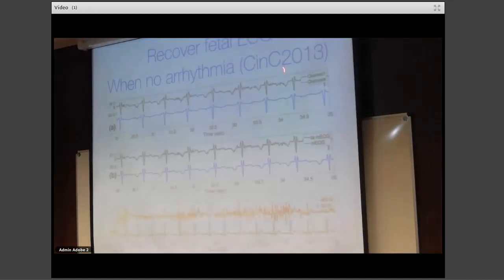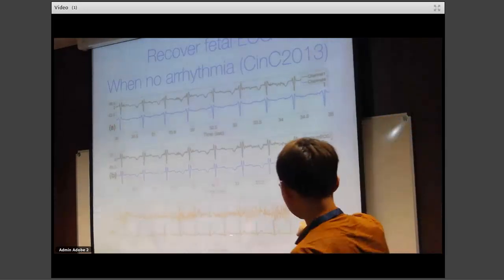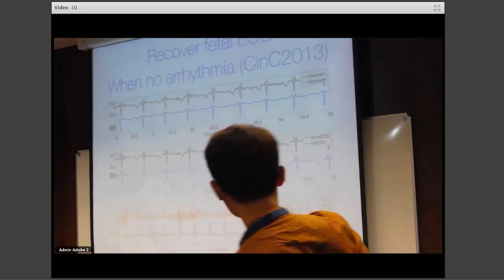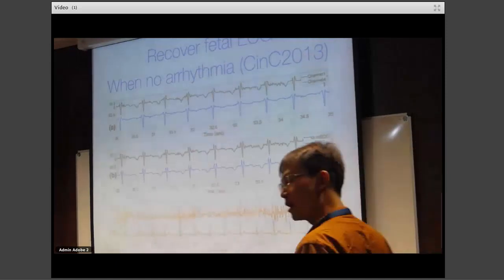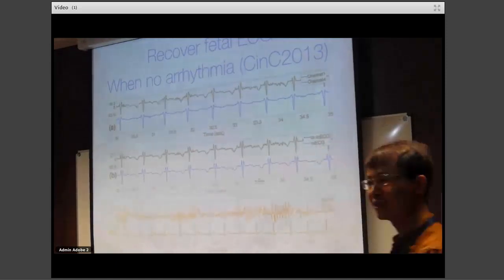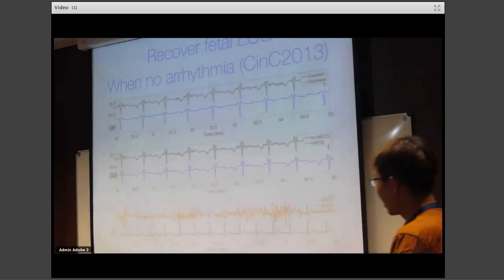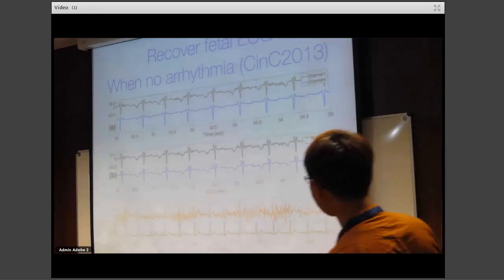And from a real database, there's no arrhythmia, and this is the recovery result. As you can see with your eyes, only from 2 channels we can recover PQRST, almost everything. I also have a table, which I don't show here, comparing what you can get for the PR interval, QT interval, R height, R interval, many things which you can compare. It's all in the paper.